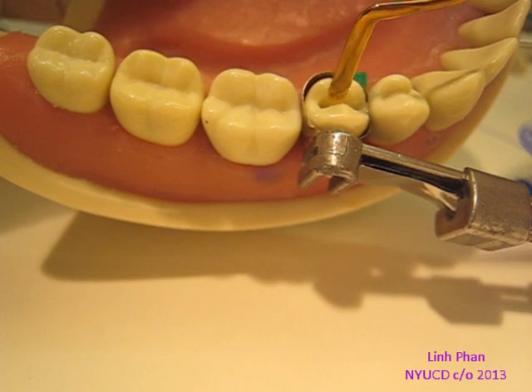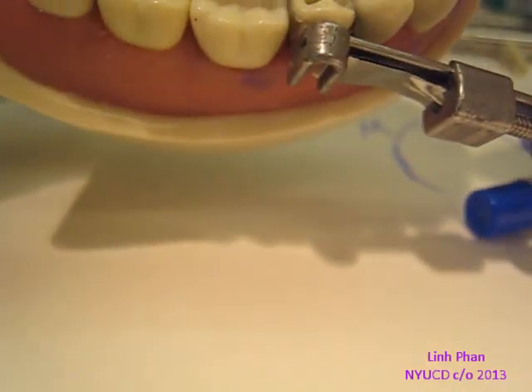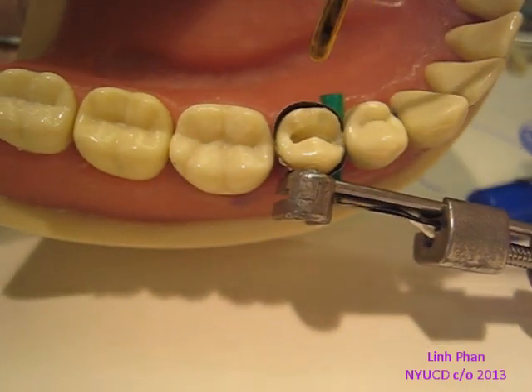The thing with composite, though, is if you don't touch it for a while, it's kind of fluid and it tries to fill the space. So as soon as you get a shape that you like, cure it and lock it in.